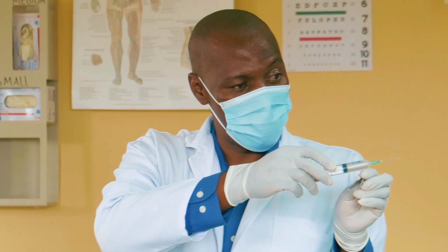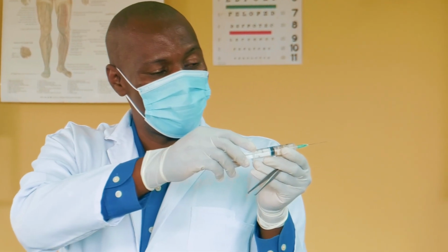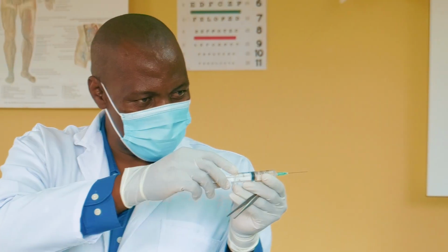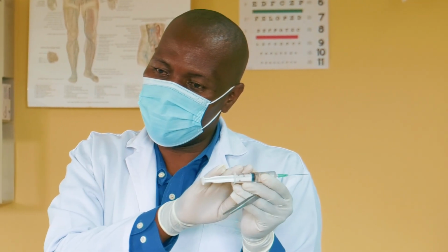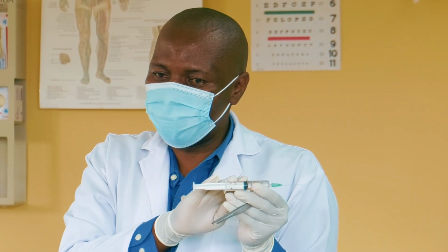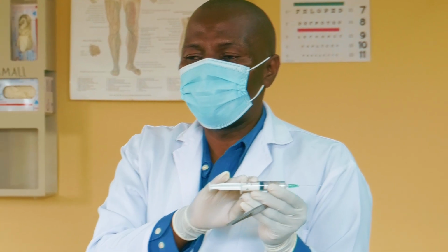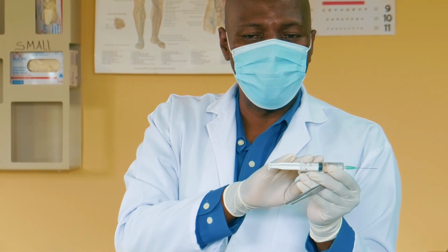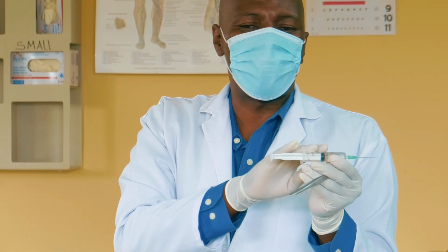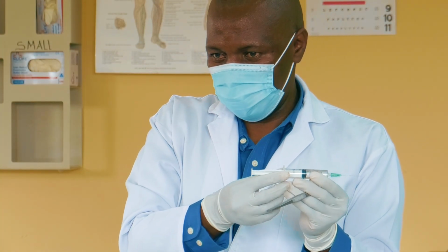Why am I withdrawing first? I want to check if I'm in a blood vessel. We don't give this drug in a blood vessel. Right? Lignocaine can cause hypotension. Others, depending on the type, can cause hypertension. The patient can go into shock. Others can cause hypoglycemia. The patient may die before you even finish. Cardiac arrest and the like.